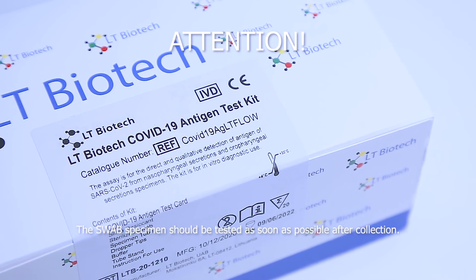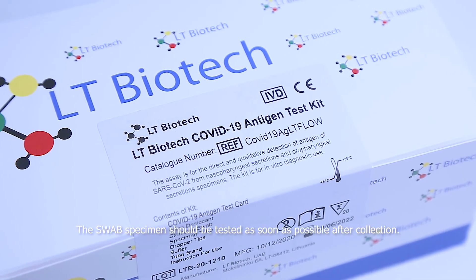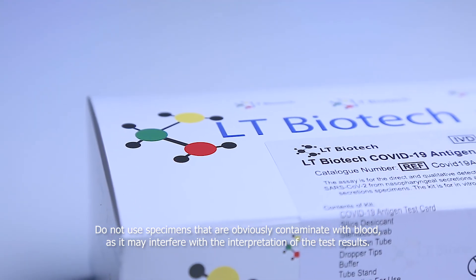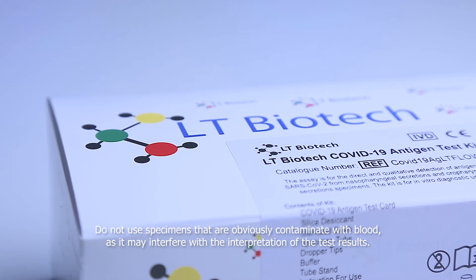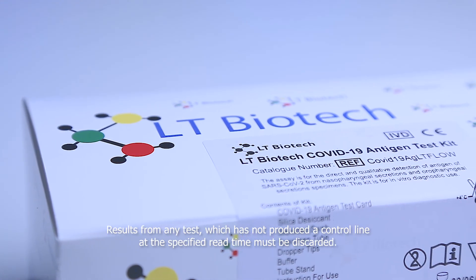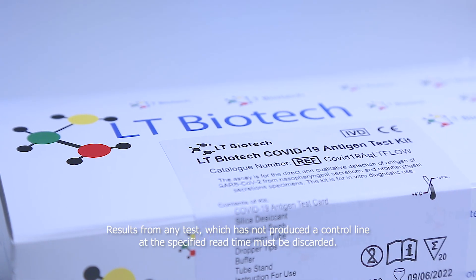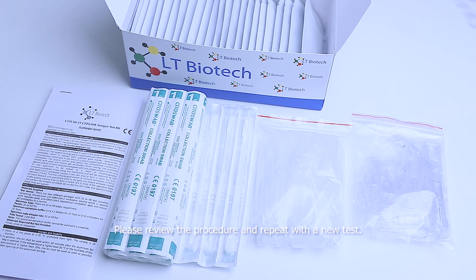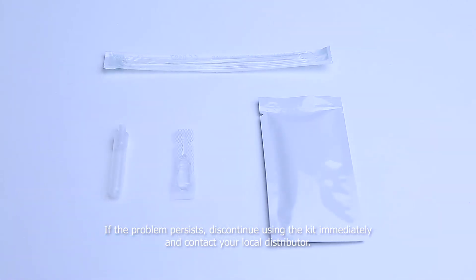Attention! The swab specimens should be tested as soon as possible after collection. Do not use specimens that are obviously contaminated with blood as it may interfere with the interpretation of the test results. Results from any test which has not produced a control line at the specified time must be discarded. Please review the procedure and repeat with a new test. If the problem persists, discontinue using the kit immediately and contact your local distributor.